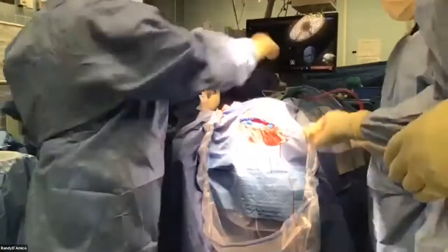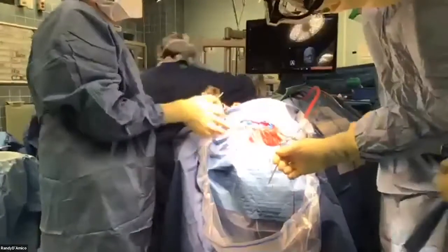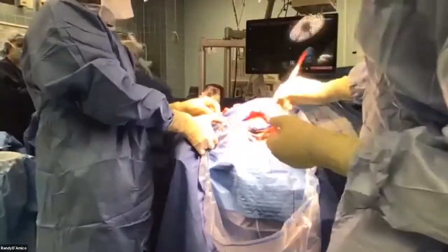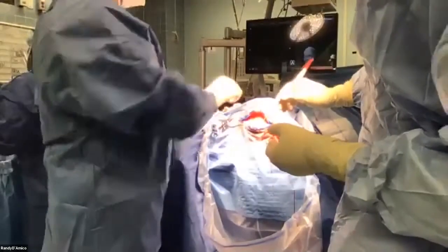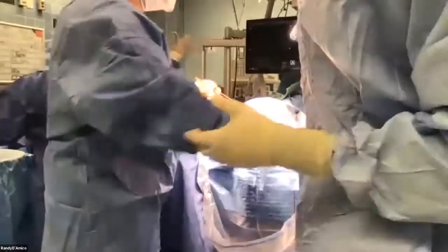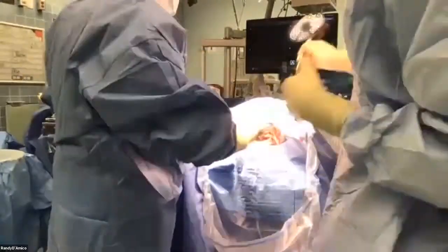I'll help out. Hey, everyone, I heard it's a little bright. You'll get to see more in a little bit. We're just going to help move things along. Like I said, we're preserving the pericranium here, which is a soft, mobile layer on top of the skull. And that's going to be used to repair the dural defects. Since this thing grows in the dura, you want to remove as much dura as possible.